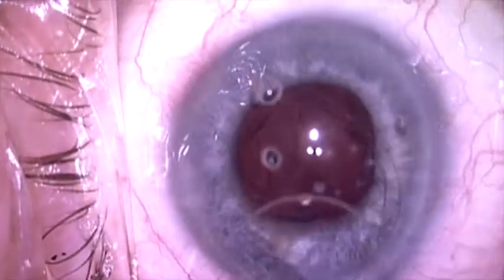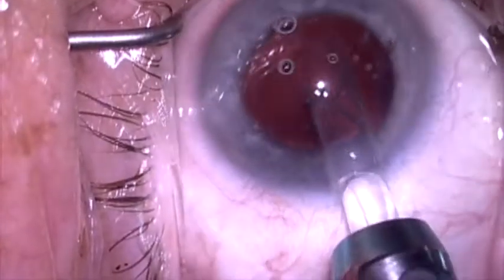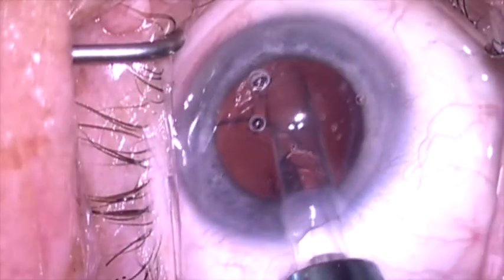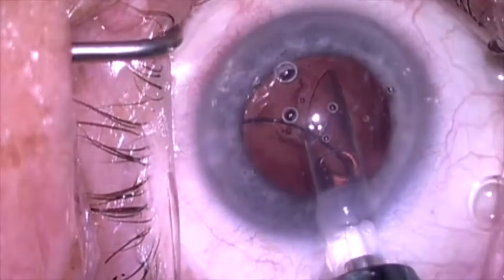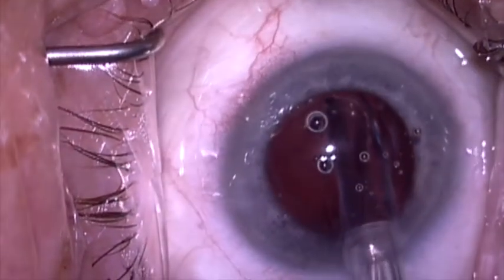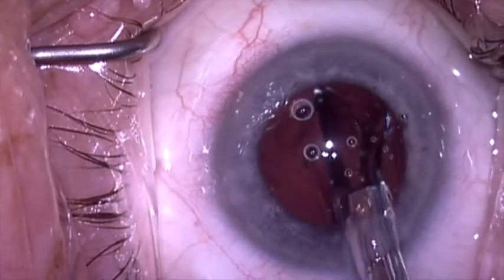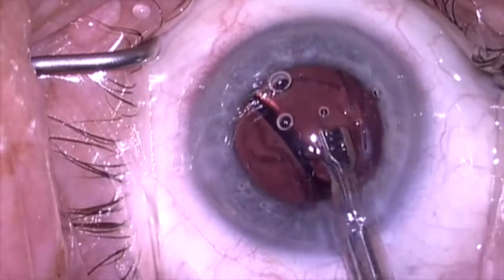Then we're going to put a new three-piece lens in the capsular remnant, under the anterior capsule, by carefully injecting the leading haptic just under the anterior capsule rim. We don't want to angle this too posteriorly because it'll go through the opening in the posterior capsule. So I'm very carefully going to slowly advance this right up against the anterior capsule rim and let the lens unfold up against the anterior capsule rim.